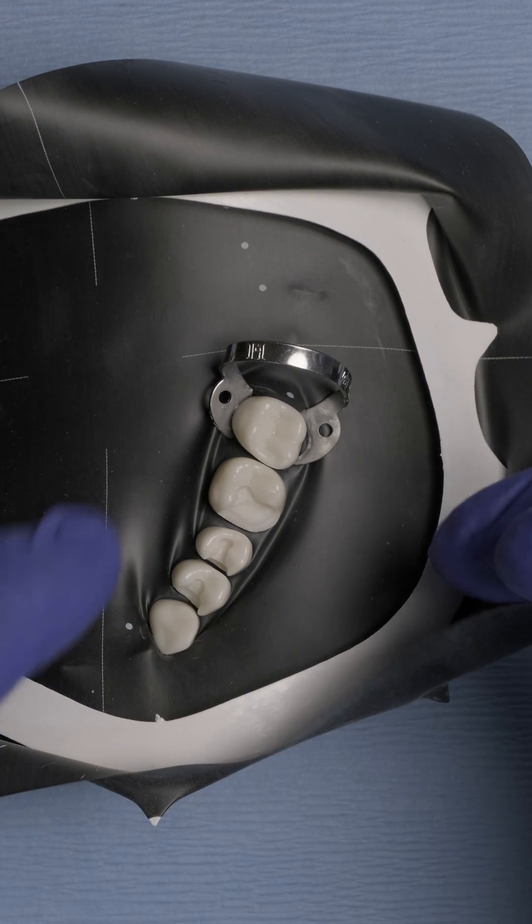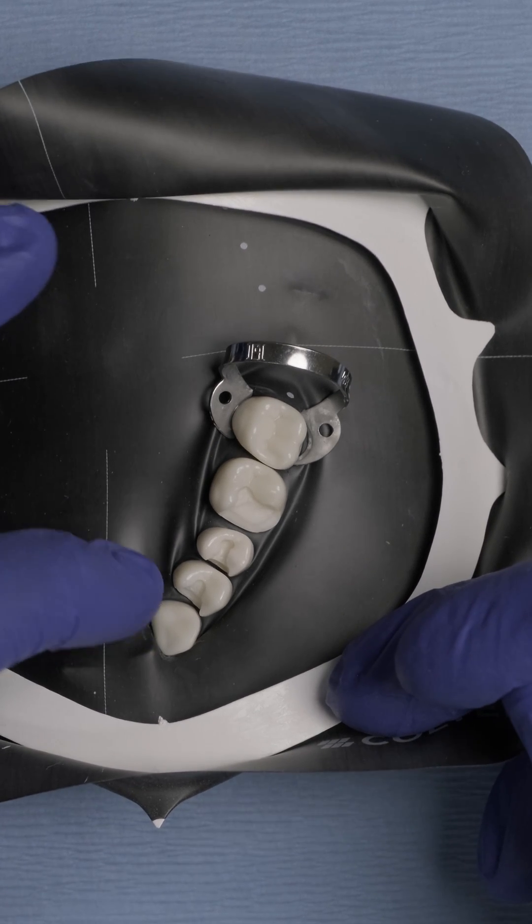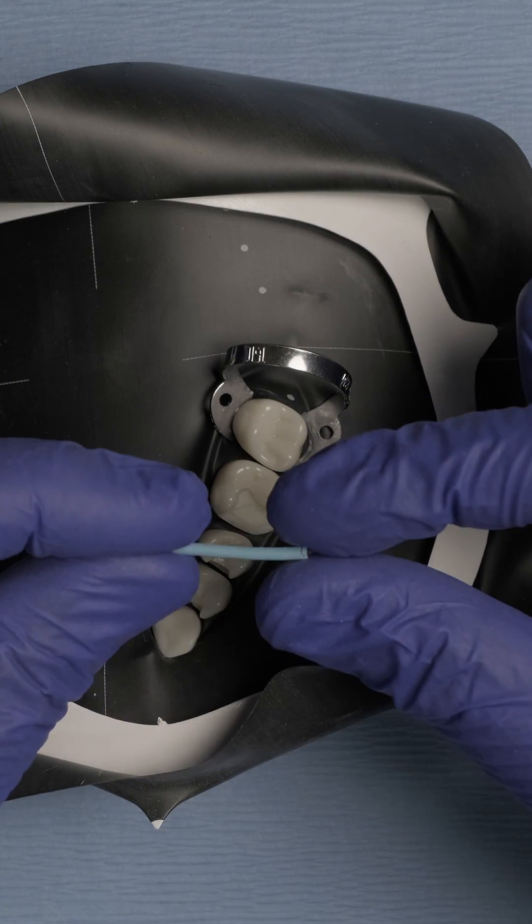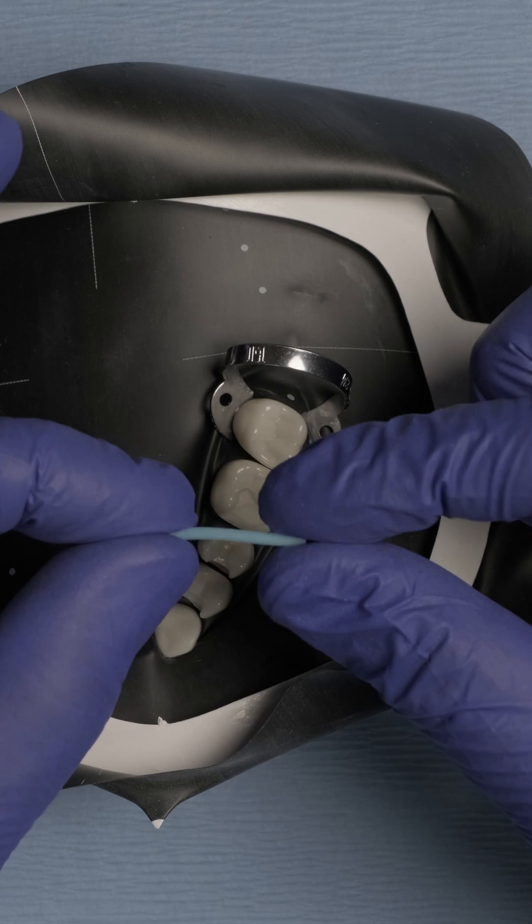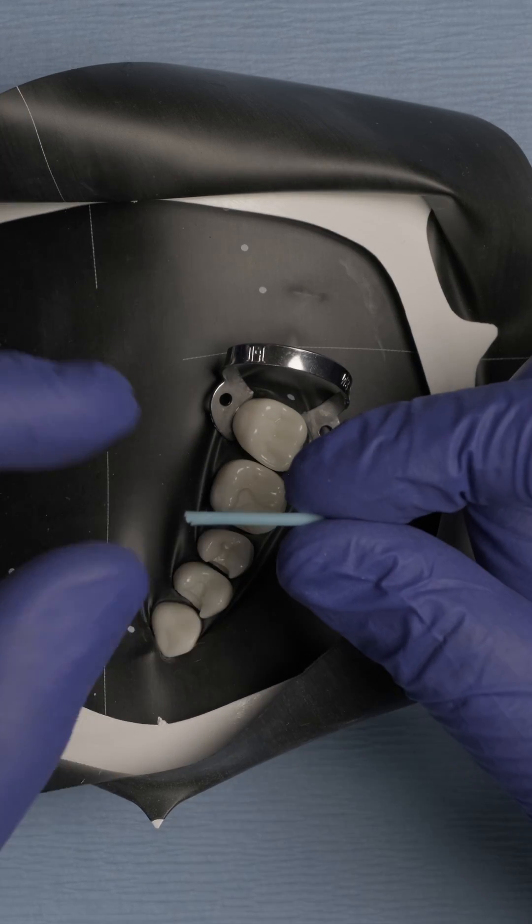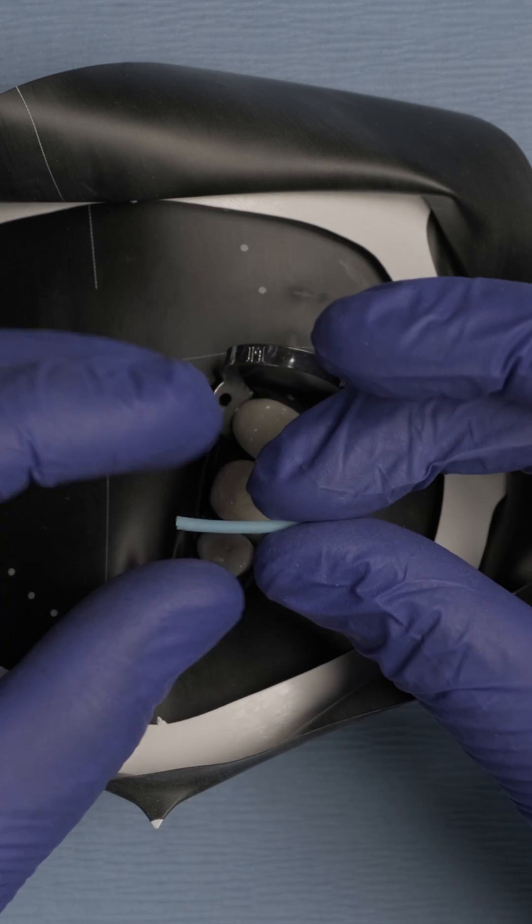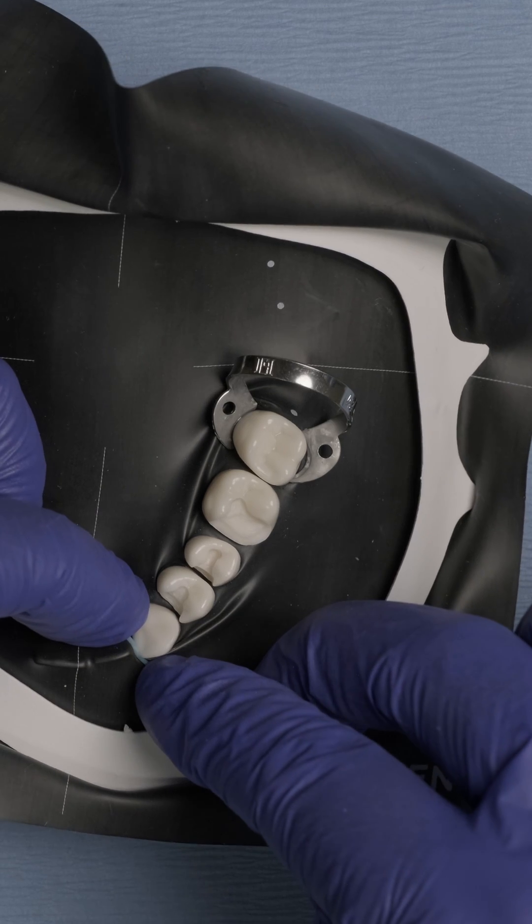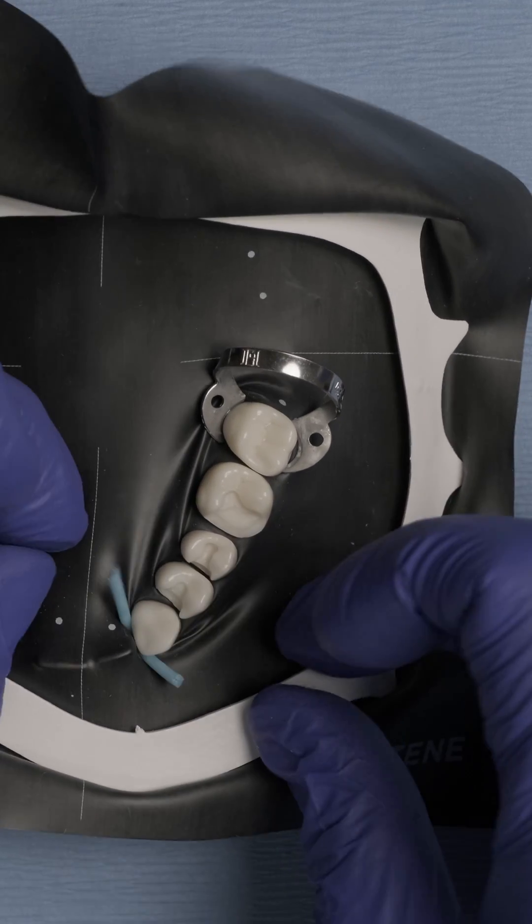At this point, all we need is to secure our rubber dam on the mesial aspect. The best way to do that is by using these wedgets. I cut them approximately ten millimeters long. I have them pre-cut in my office. All you have to do is just stretch the wedget and floss through the contact area and let go.